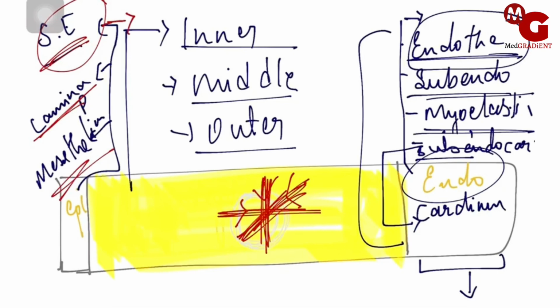Inside there are the arteriae coronariae with their branches and the coronary sinus with its affluents. What are the arteriae coronariae? They are the coronary arteries that supply blood to the muscles of the heart.